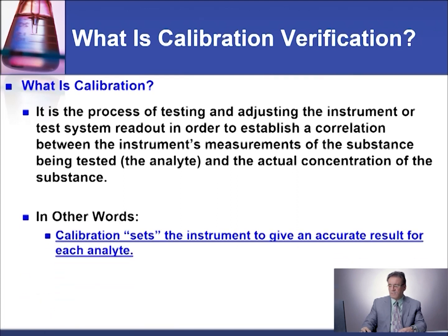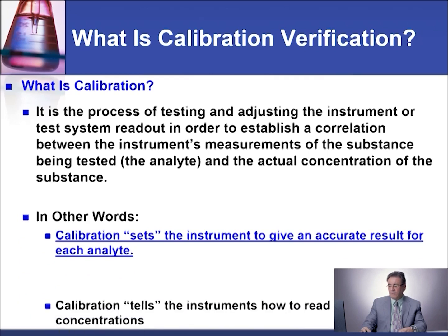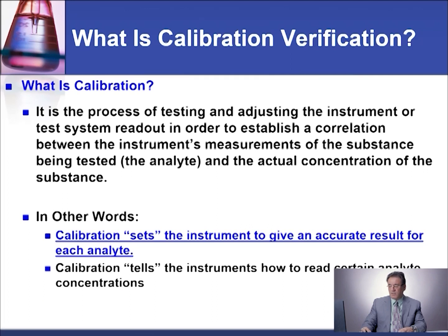In other words, calibration sets the instrument to give an accurate result for each analyte. Calibration tells the instrument how to read certain analytes' concentrations.